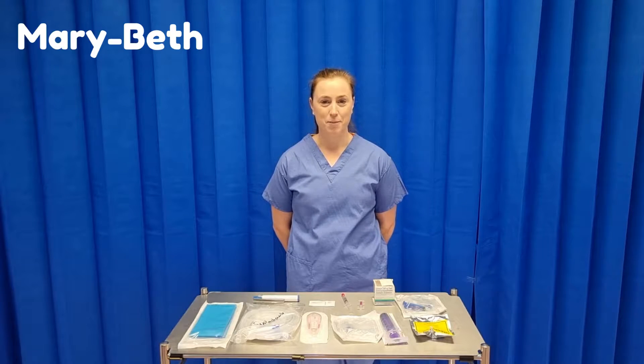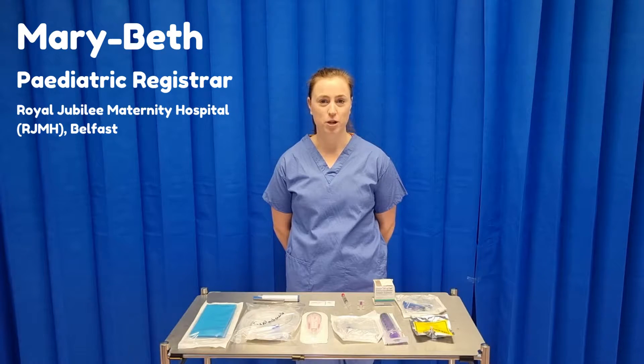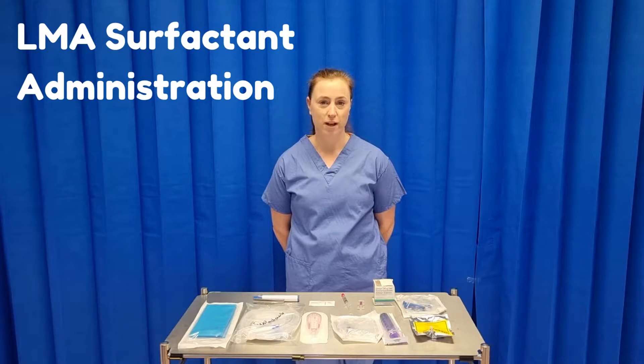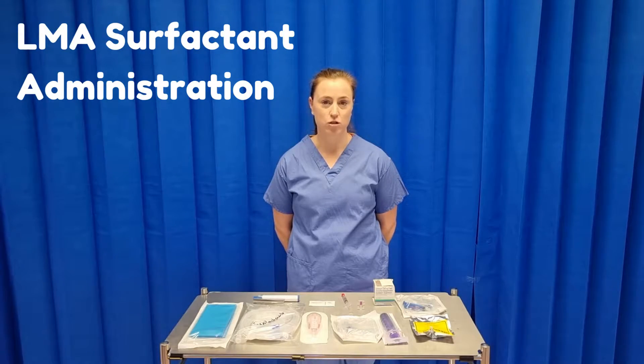Hello, my name is Mary Beth. I am one of the paediatric registrars in the Royal Jubilee Maternity Hospital in Belfast. Today we are going to demonstrate how to administer surfactant via LMA, which is a relatively new skill being introduced in our unit.